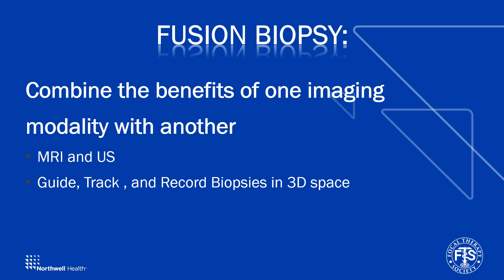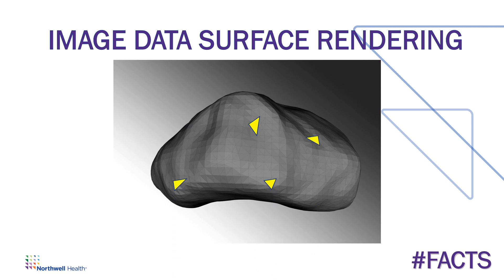Fusion technology itself allows us to guide, track, or record biopsies in 3D space. See these small triangles being placed over this mesh image? The data set looks the same to the computer from the MRI or the ultrasound — it's a surface mesh placed over the object. The computer uses a mathematical equation to match these triangles, which are unique to the contour of the prostate. We'll show you how this aligns in a moment.